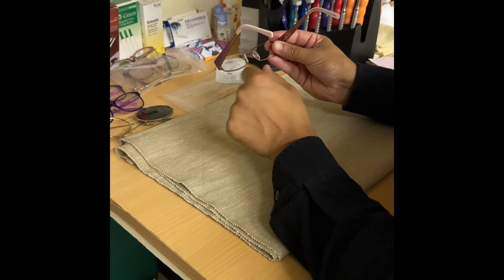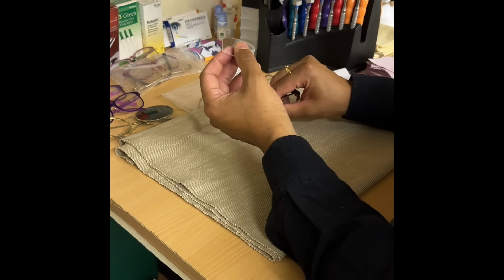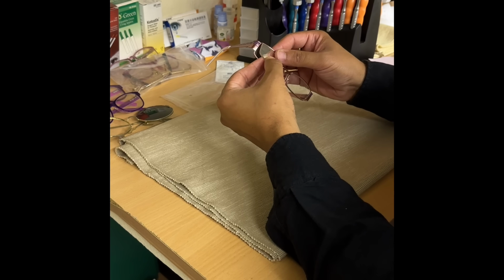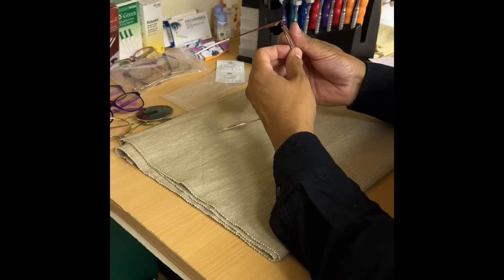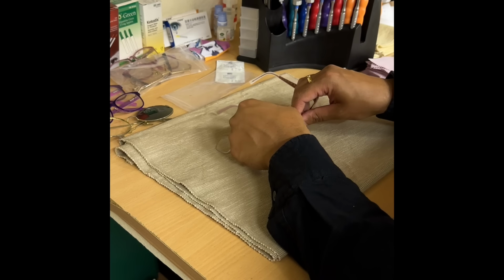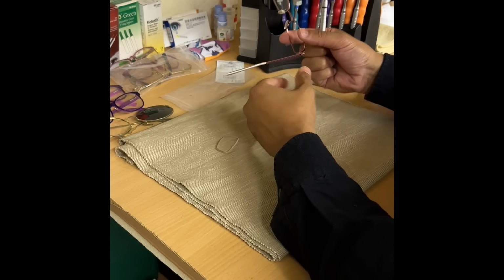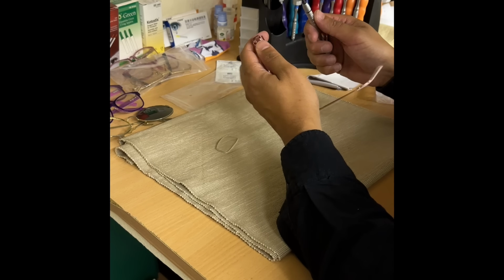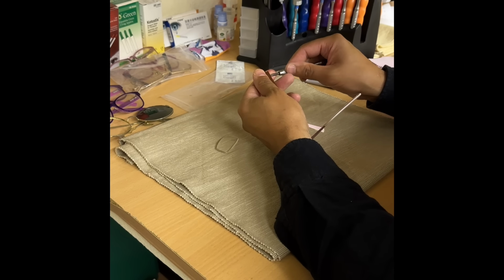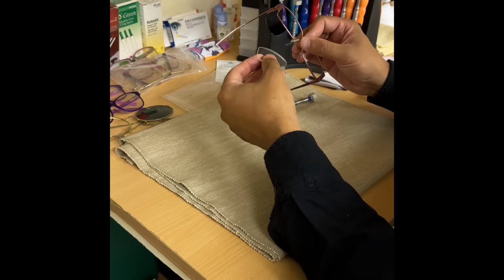I'll slowly try and tighten up those joints. But you have had the lens fall out. Let's have a look. Yes, the screw is still intact. Let's see if we can get this back into play, back into the game. Just loosen this screw a little. Hopefully we can get the lens back in.